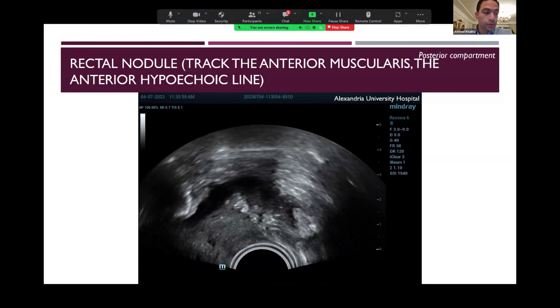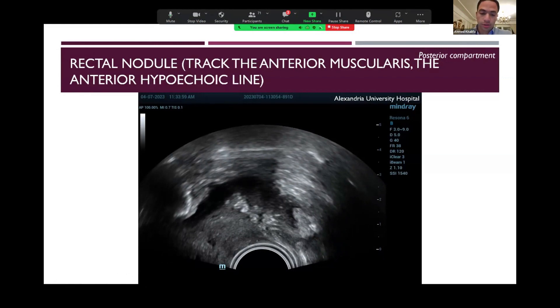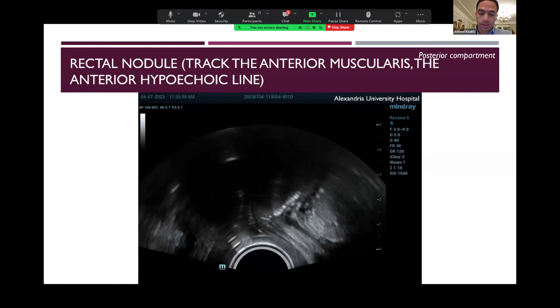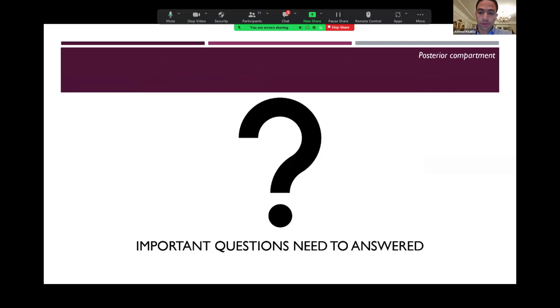In this clip we check a patient with a rectal nodule and see how we track the anterior rectal muscularis, which is the anterior hypoechoic line. You can identify the anterior rectal muscularis here and keep on tracking it gently and meticulously, navigating with the probe until we follow the anterior rectal muscularis and actually see a large curved irregular hypoechoic lesion — this was actually a large upper rectal endometriotic nodule. It is very important to track the anterior muscularis to exclude the presence of any endometriosis.